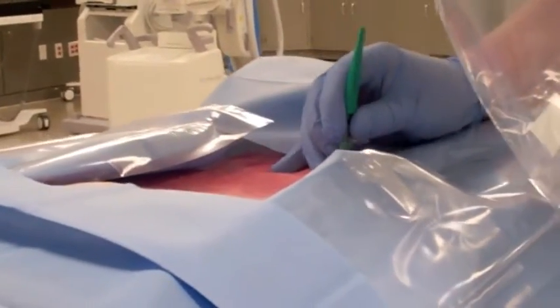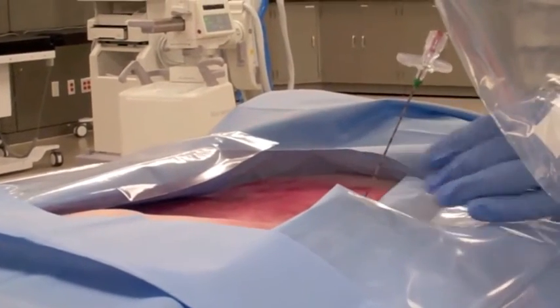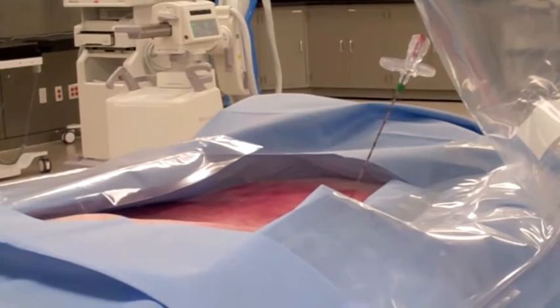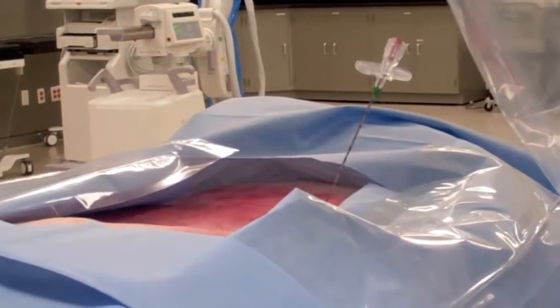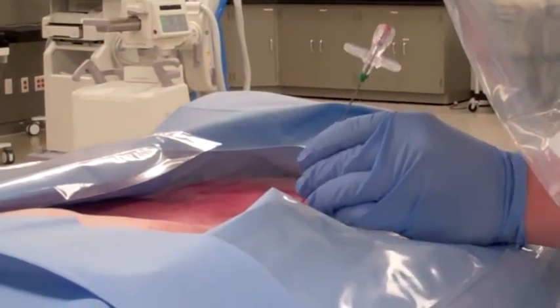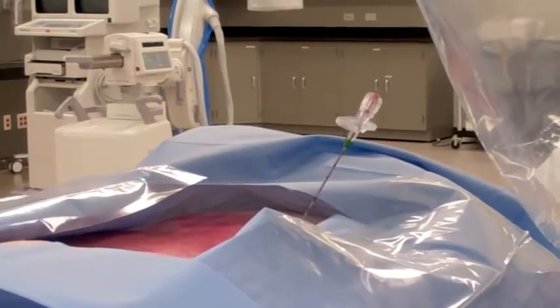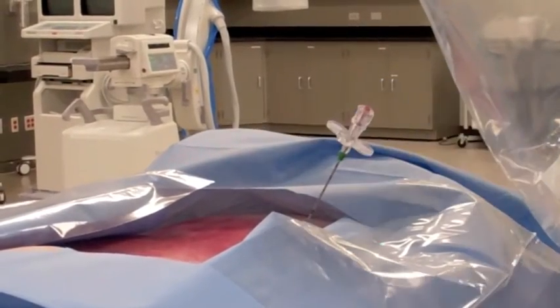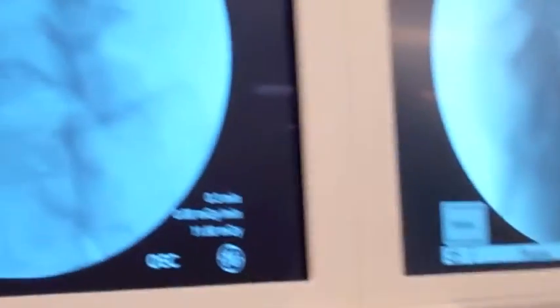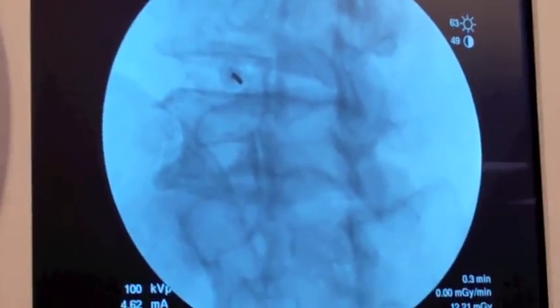I'll make a small incision with a scalpel, and then place my needle through the scalpel incision. You can see the needle going directly towards where we were aiming, and now I can feel the needle going into the disc.